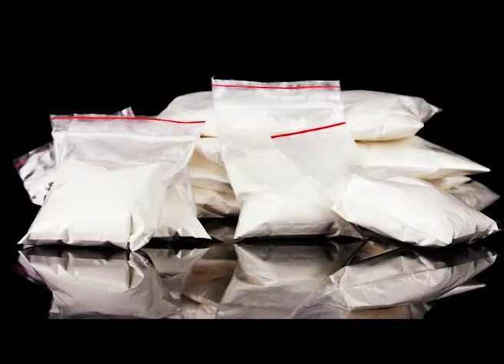The composition of multiple container items is as follows. If there are less than 10 packages, all packages should be sampled. If there are 10 to 100 packages, randomly select 10 packages. And if there are more than 100 packages, randomly select a number of packages equal to the square root of the total number of packages, rounded to the next higher integer.